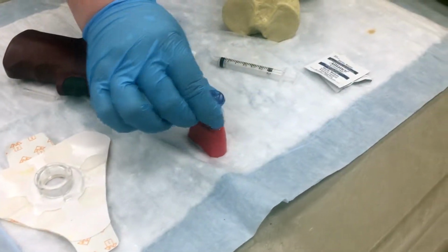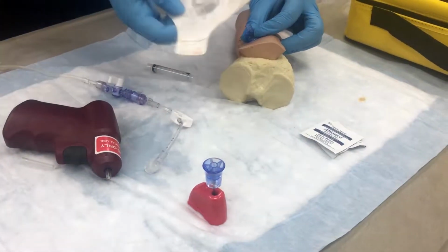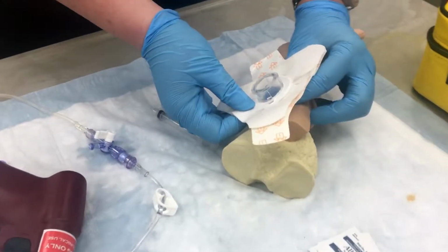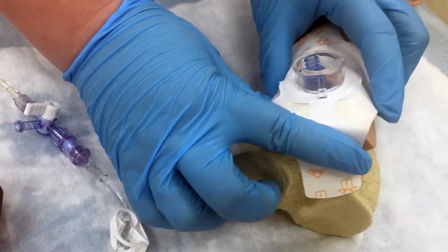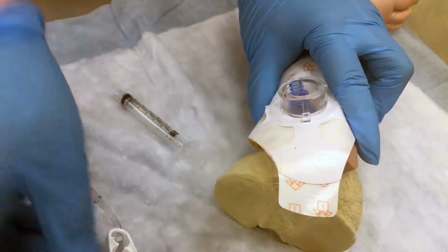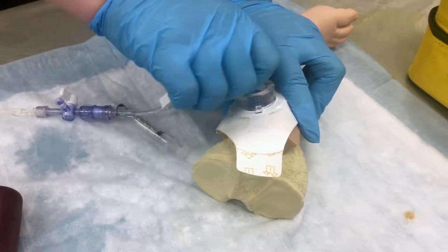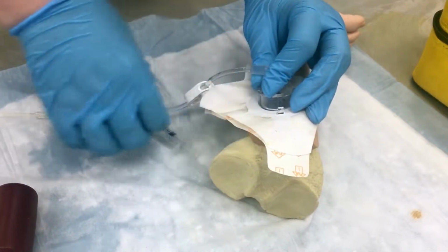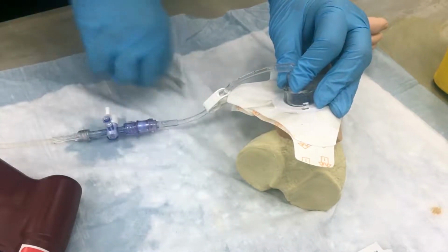Use of a commercial stabilizing device is recommended, such as the Easy Stabilizer. Place the stabilizer over the catheter and adhere to the skin. Attach a primed extension set with a stopcock firmly to the hub. For patients responsive to pain, consider 2% preservative and epinephrine-free lidocaine, following institutional protocols for amount desired.